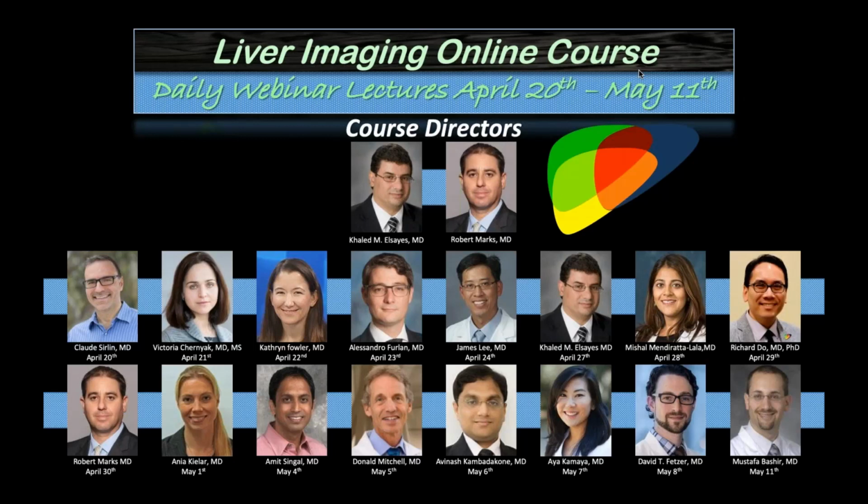Hey, by the way, hello. I think that's a good point. I think that the concept is the same. The overall concept is that we use non-categorizable for diagnostic imaging and non-evaluable for treatment response imaging. When due to image degradation or image omission, you simply are not sure, not just not sure, you can't even decide whether something is more likely malignant or more likely benign.